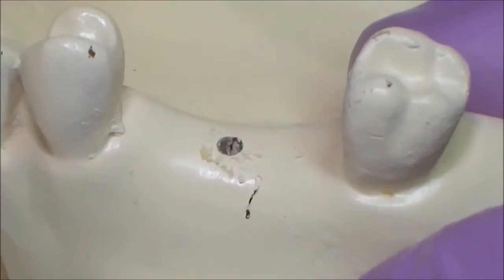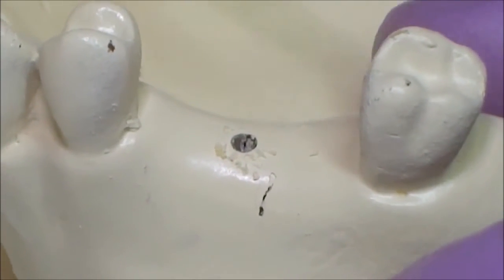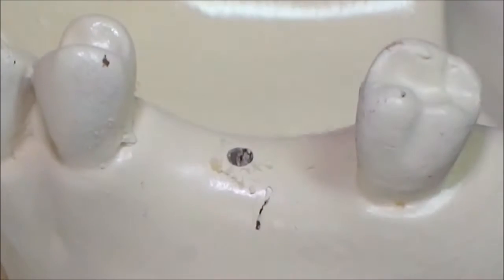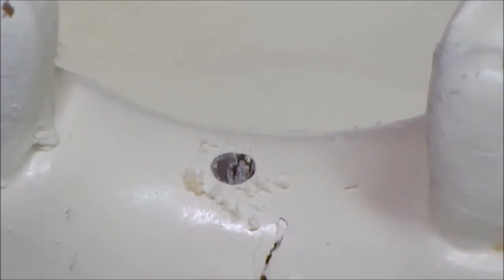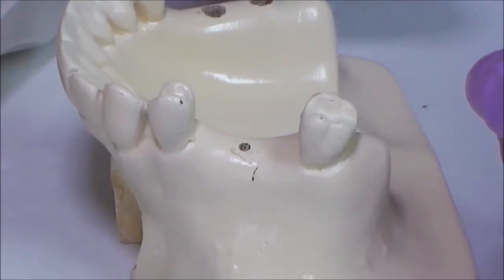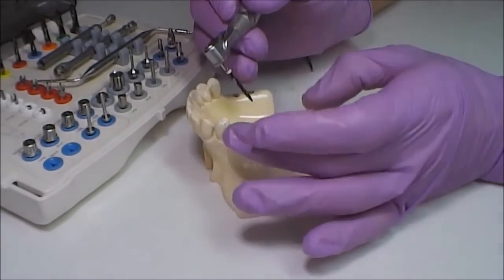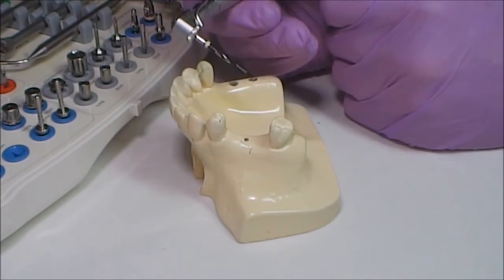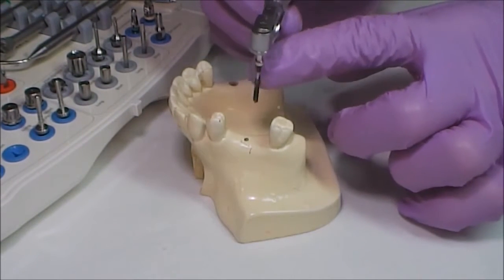Different numbers of rotations are used during the drilling. The narrower the diameter of the drill, the more rotations are allowed. Acceptable standards are within 200 to 1200 rotations; 500 rotations is the average recommended number. With every subsequent drill, the number of rotations is decreased by an average of 150 to 200 units. We have chosen the depth of drilling, fixing it visually or by placing a stopper onto the drill. This is the pilot drill — it sets the depth of drilling and access for the future implant.